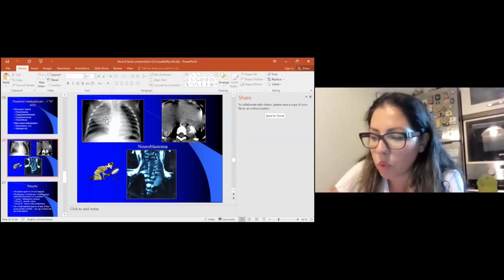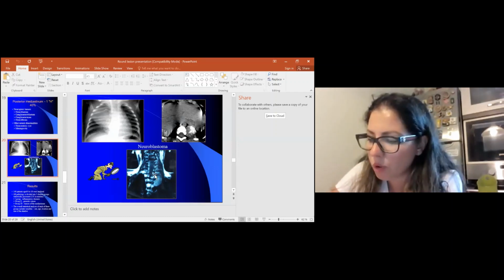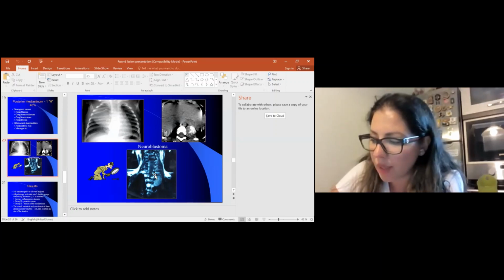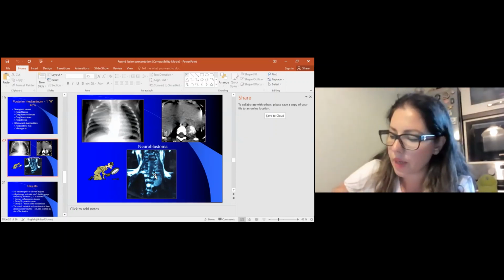Diagnosis is confirmed with CT, which can show solid masses with soft tissue attenuation, which may have calcification and involve ribs and vertebrae. MRI can demonstrate multiplanar sections of the spinal cord and eventually intraspinal extension of the tumor, which is very important for surgical intervention and therapy plan.